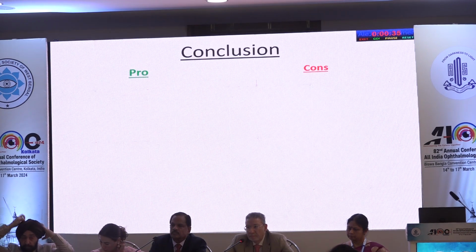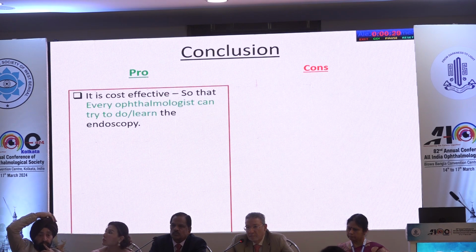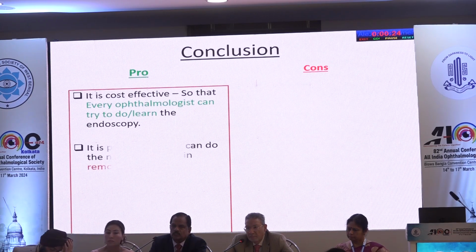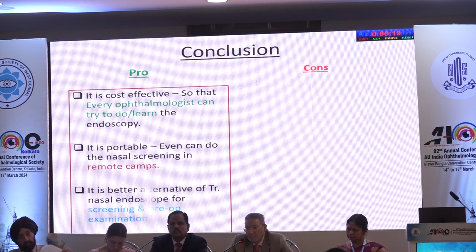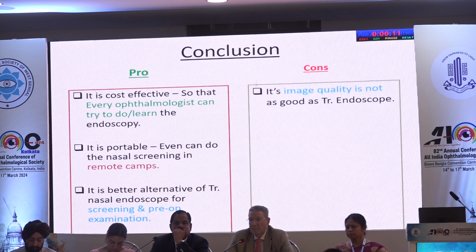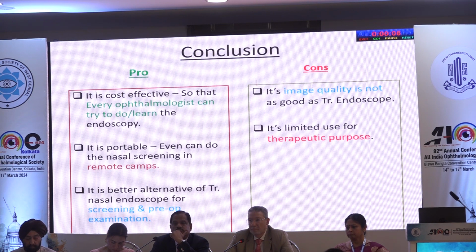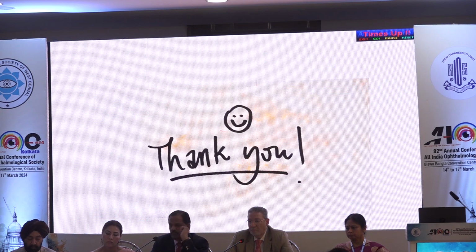Then the conclusion, which is divided into pros and cons. First of all, it is cost effective, so every ophthalmologist can try to learn endoscopy. Second, it is portable, so one can even do nasal screening in remote camps, and it is a better alternative to the traumatic traditional nasal endoscope for screening and pre-op examination. Cons: its image quality is not as good as the traditional endoscope, it has limited use for therapeutic purposes, and more observational studies by different hands are needed to understand its usefulness in dacryology. Thank you.